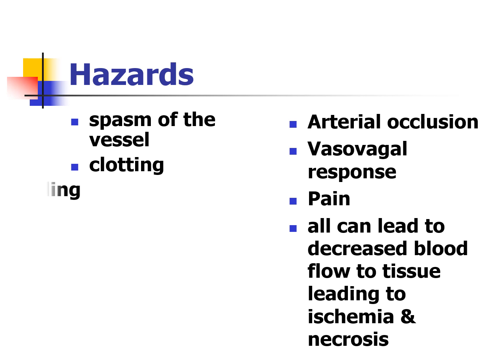Clotting and bleeding, I'll put both of these on here. Clotting and bleeding are big ones here. They can have a clot that forms that can travel around their system. Same thing with bleeding if they're on heparin or blood thinners, if they have atrial fibrillation and they're on blood thinners. Some of these people have very low platelets, and it depends on what diseases they have going on. So before you go draw a blood gas, we want to look at their INR, which is their ability to clot, and platelets, which should be over 100,000. You guys should know these numbers so you know whether or not it's safe to do the blood gas, or how dangerous that procedure potentially is.